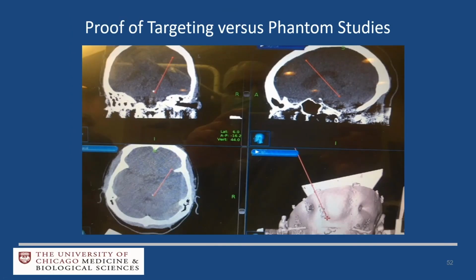And this is just another example of a brainstem tumor where you can always show your phantom precision in stereotactic planning and scans, but adding a titanium marker at the calculated target position for your biopsy and then fusing it back and fusing your calculated trajectory with the intraop CT shows how good and how precise you really are.